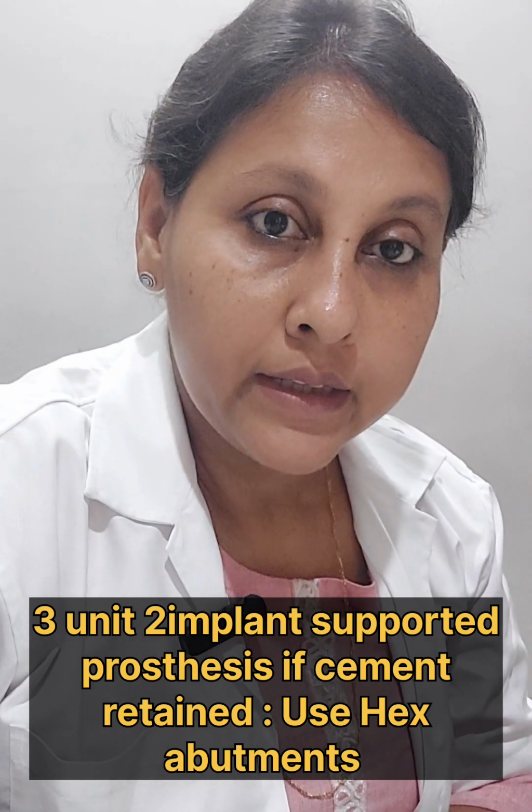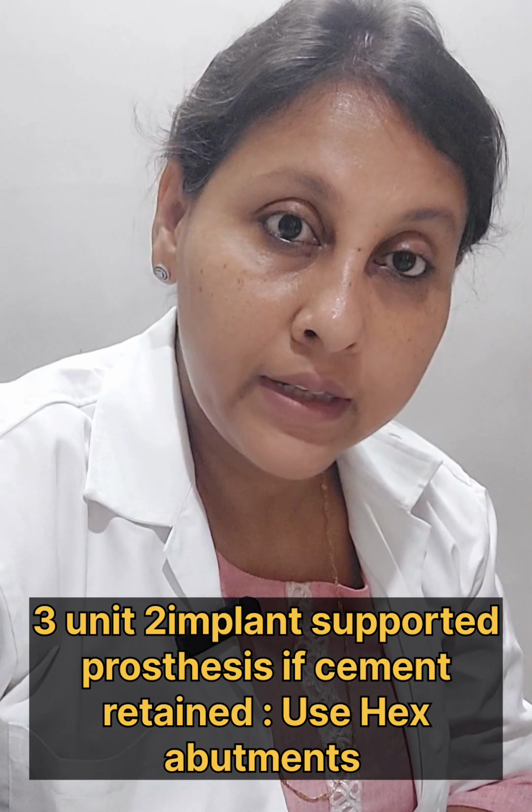If we are planning the prosthesis to be cement retained, then we definitely have to use a hexed abutment. Otherwise, we won't get sufficient retention in such cases. Another reason for this is that in the case of hexed abutments, the abutments are fixed to the implants first, then the prosthesis is attached to it.